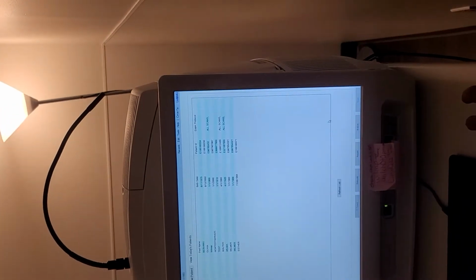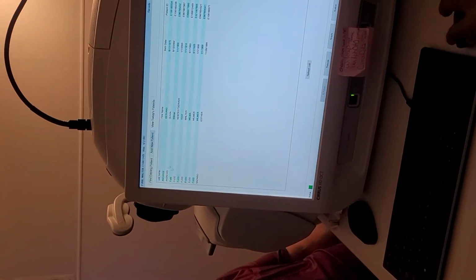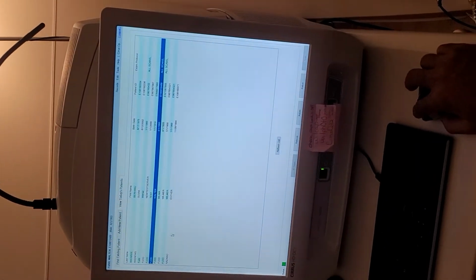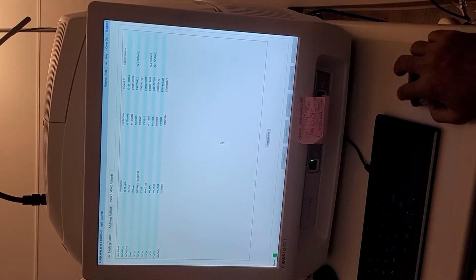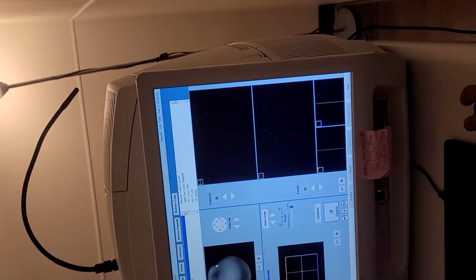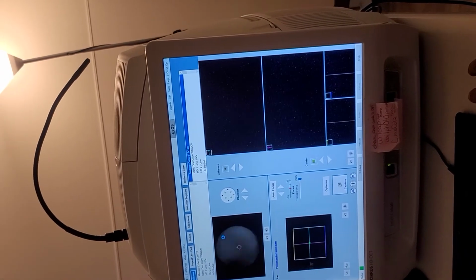Now we're gonna do his left eye, correct? What is his name? Walter. Go back to the one that you were in, which was Walter. Acquire. And now where is he gonna place his chin? Place your chin towards the right, white line. Because now we are going to check your left eye.